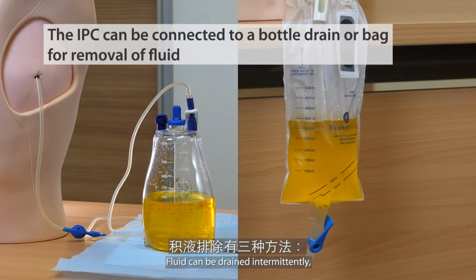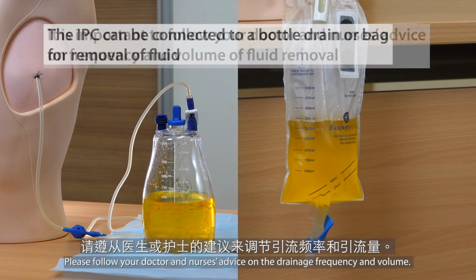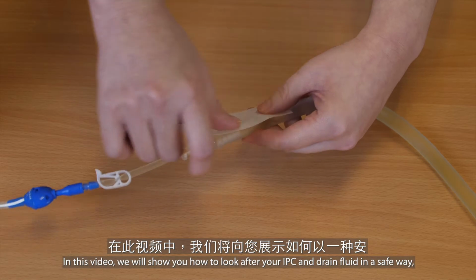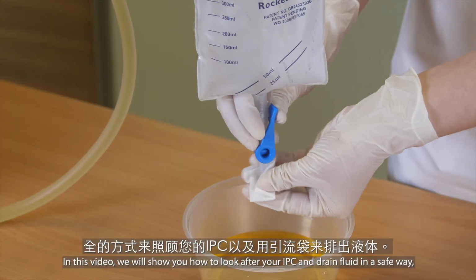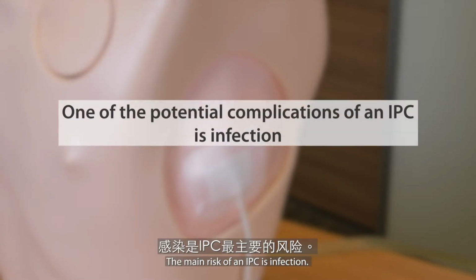Fluid can be drained intermittently using a pre-vacuumed drainage bottle or continuously using a drainage bag. Please follow your doctor and nurse's advice on the drainage frequency and volume. In this video, we will show you how to look after your IPC and drain fluid in a safe way using a drainage bag. The main risk of an IPC is infection.